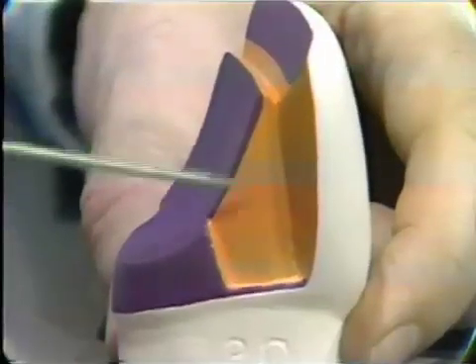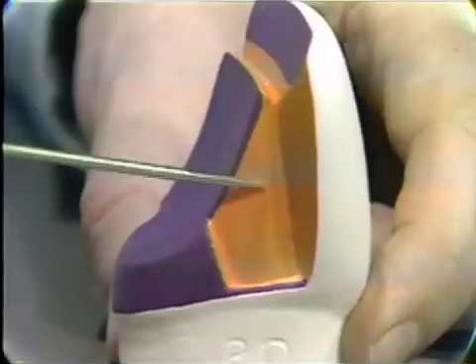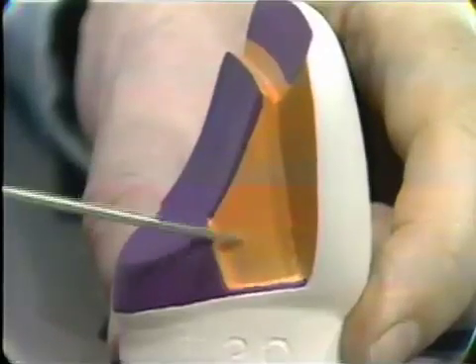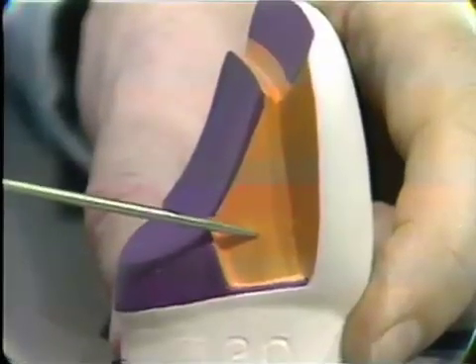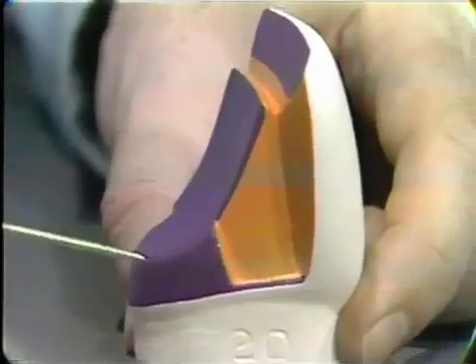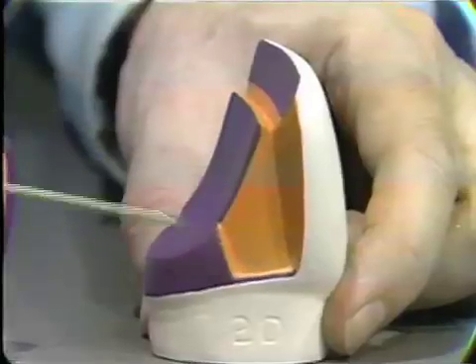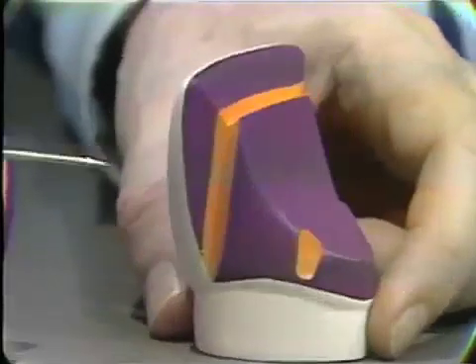This is usually done in cases perhaps where there's been a previous restoration here, perhaps a composite or a silicate material which has taken away some amount of tooth substance where the groove would normally be cut. And obviously the exact size and shape of the box will vary according to that particular lesion, but this is quite an acceptable way of dealing with it.